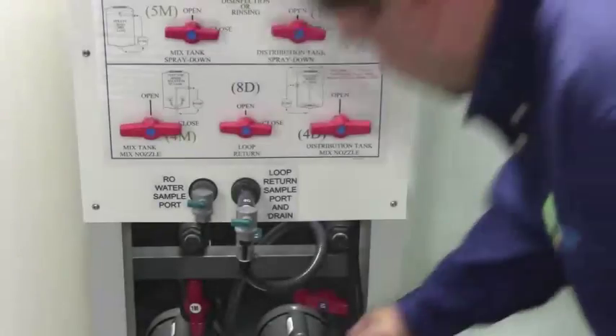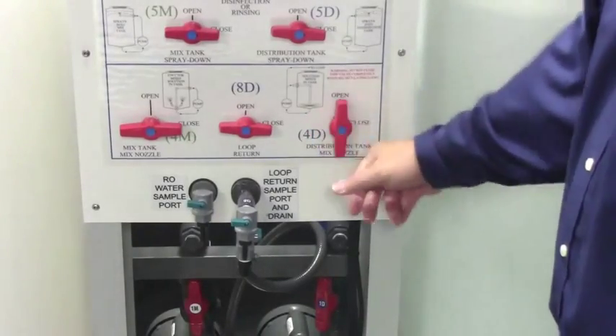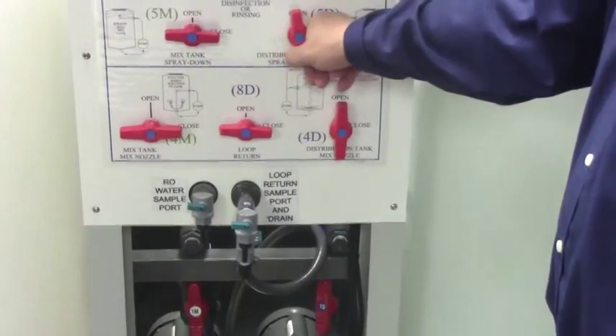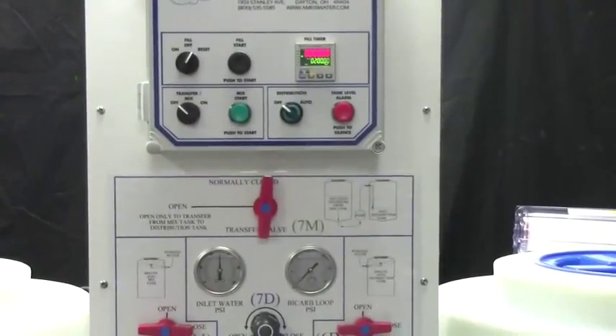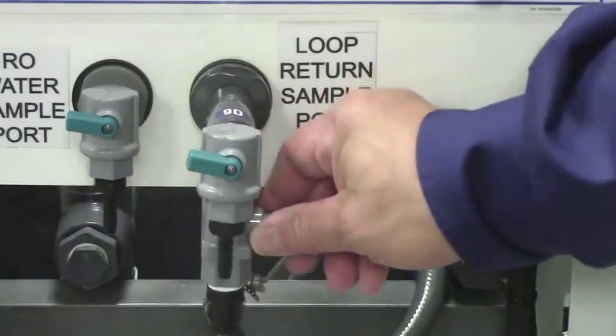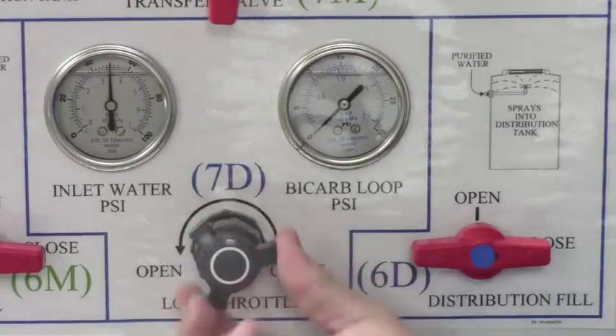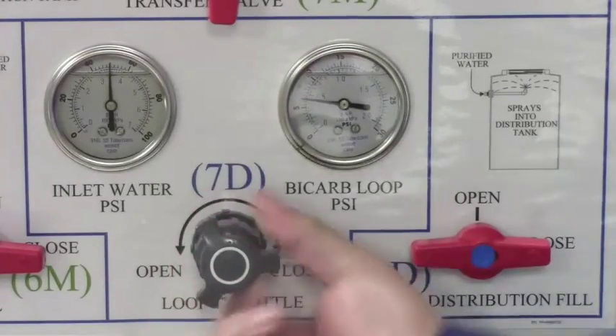Open valves 1D, 4D, and 5D. Turn the distribution switch to auto and allow the system to run for 1 to 2 minutes. Open valves 9D and 7D and let the water flow to the drain for a minimum of 5 minutes.